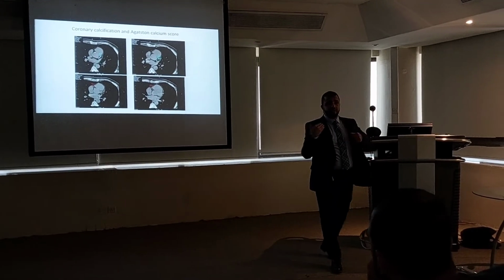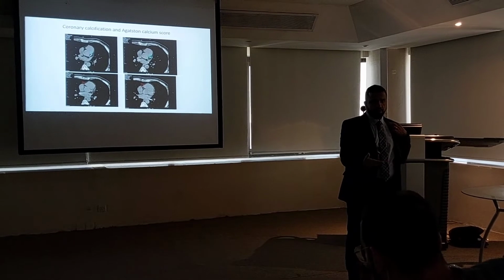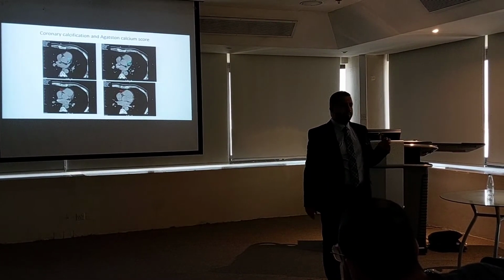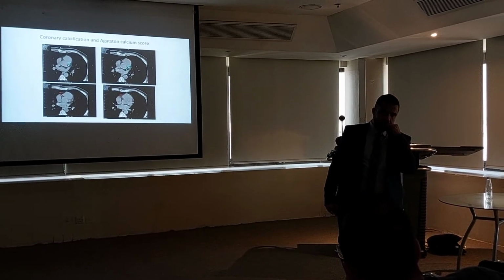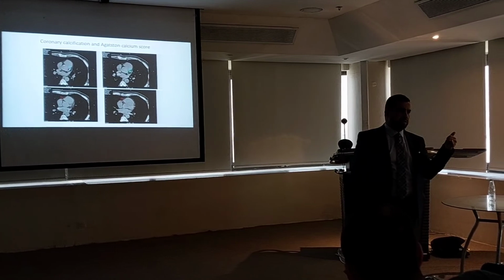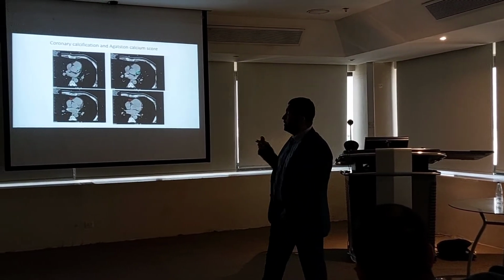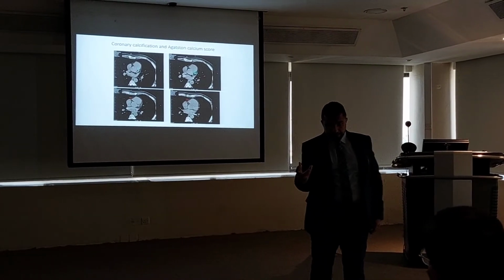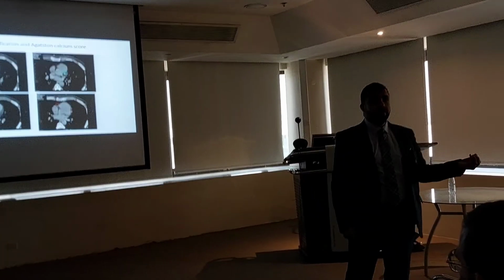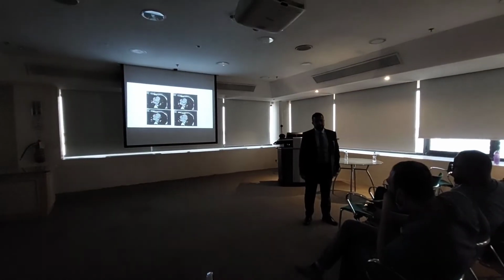Now, it's not the technologist's decision to decide I will stop here or I will proceed because the calcium is too much maybe, but I should tell the doctor I can see some calcification, please let me know whether to proceed. In some cases there is calcification that may limit the quality of the procedure, and because of that the doctor will decide no, I will stop here.